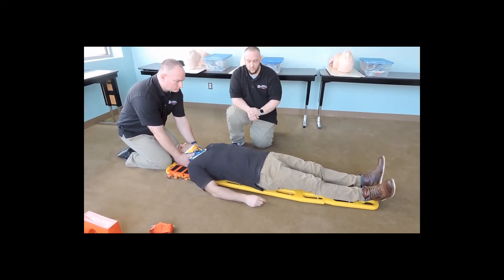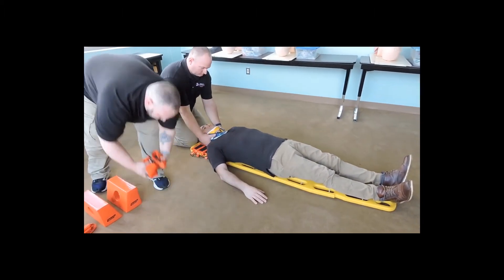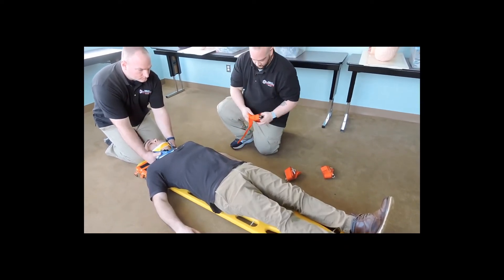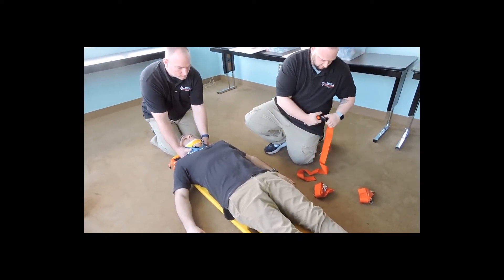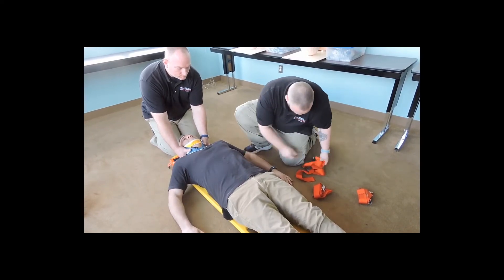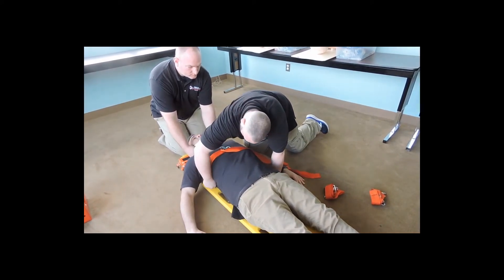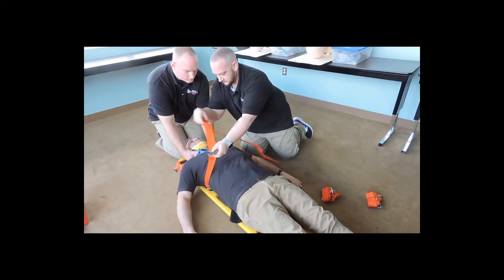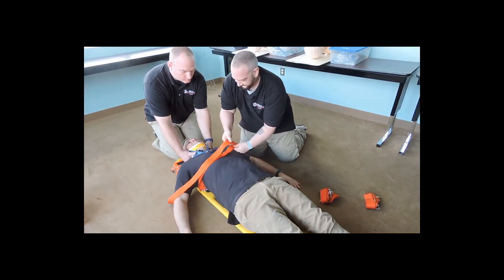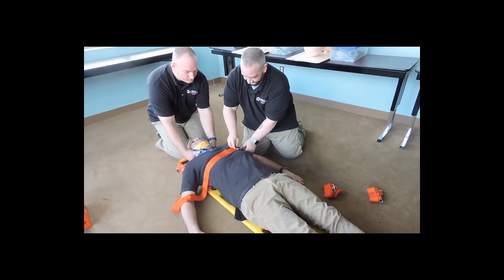Now with immobilization in place and the patient on the board, we're going to start to apply our straps to secure the patient to the longboard. We're going to use our quick clips and secure these to the board, starting up at the chest to immobilize the torso. We're going to use a feeding method so as not to grossly manipulate the patient. I want to make sure that the buckle is not over the chest in case we need to do CPR, and I would be padding these buckles that are against the skin.